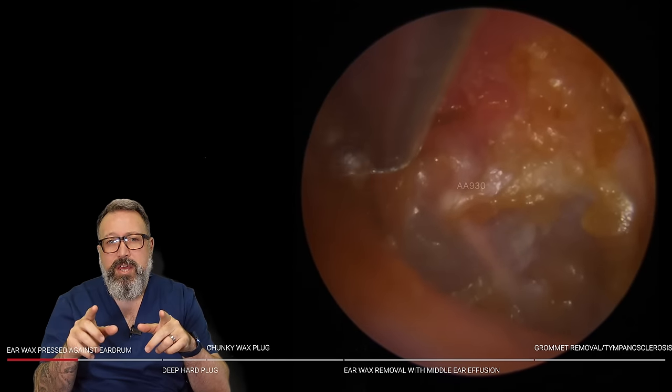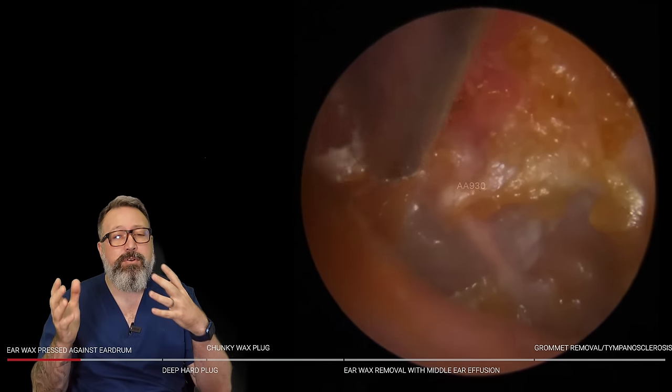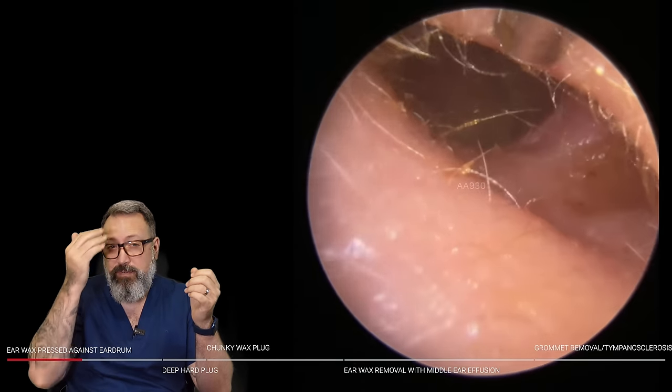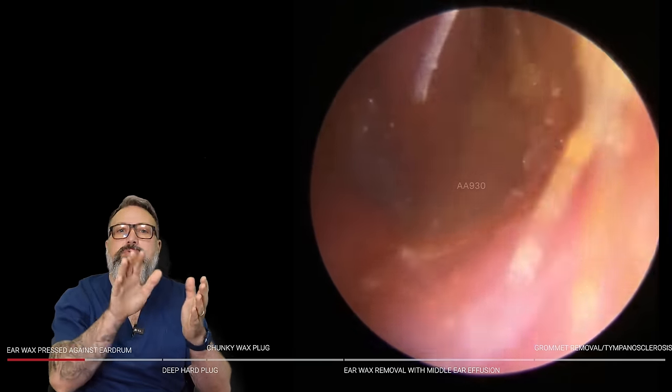I'm just tidying up around the outside edges, just in this anterior canal wall here. Don't forget: anterior means towards the front of your head, posterior means the back of your head. So we're talking about the anterior wall — closest to the face.